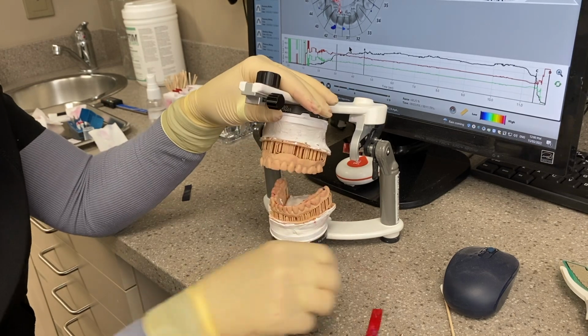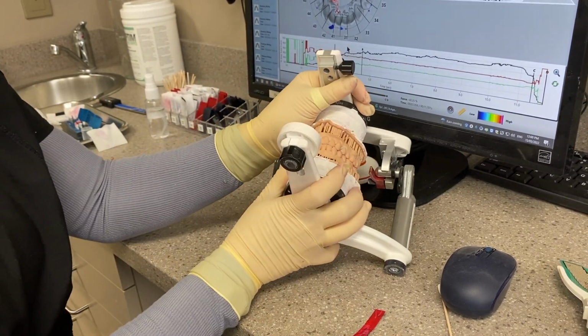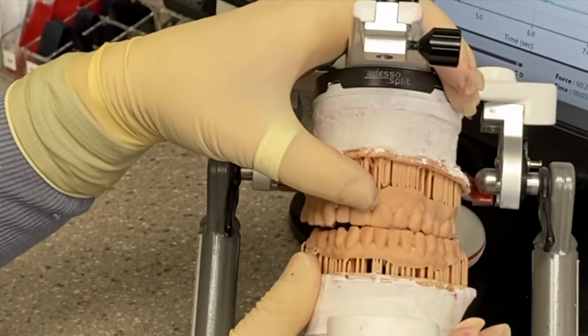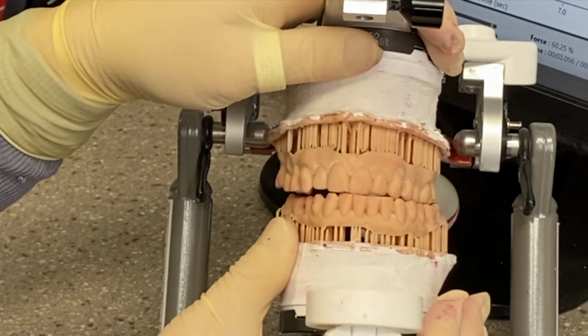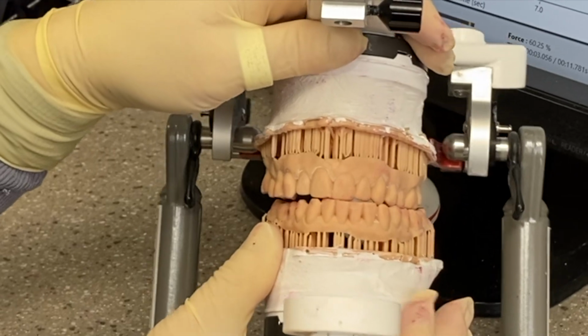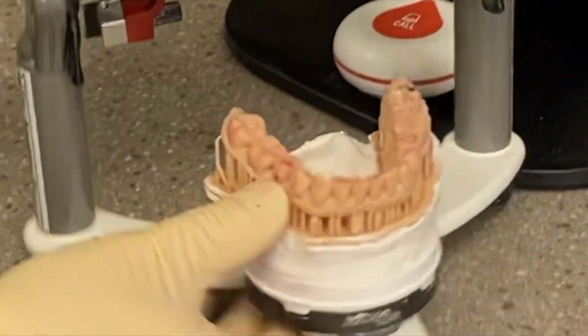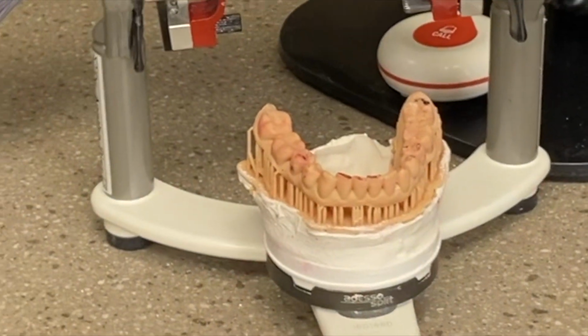So let's see where we're driving this car. She's hitting, when on the slide, right on the insides of the uppers, and we don't want to reshape those. I know she's going to want to keep her uppers the way they are, so I'm going to reshape the lower and just tuck it in a bit.